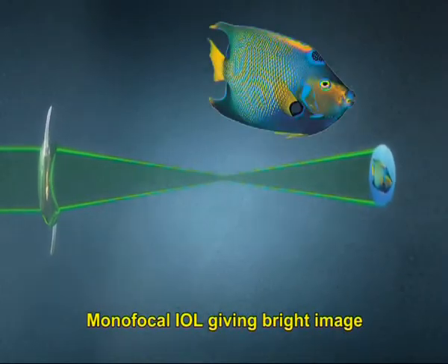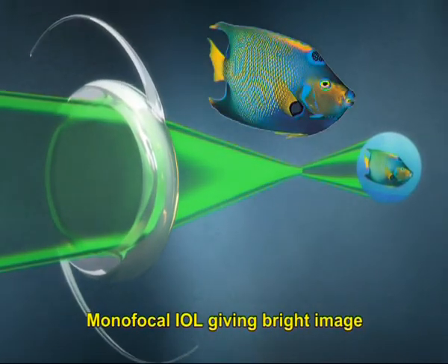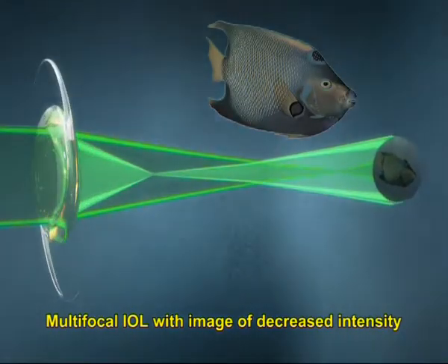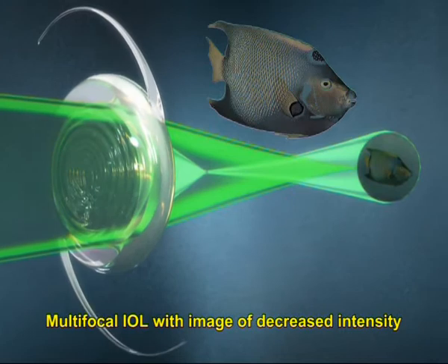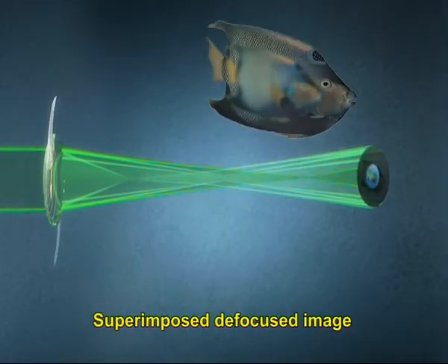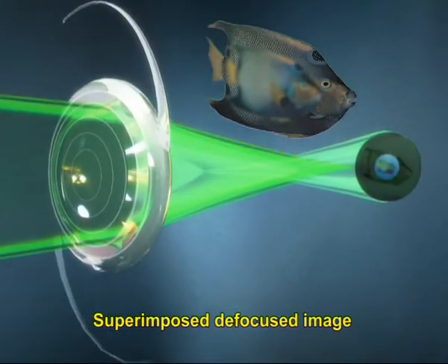Many factors have been proposed for these phenomena, the most important being a decrease in the intensity of light falling on the retina due to splitting up of incident light into multiple focal points and due to superimposition of the defocused image onto the focused image. But irrespective of these factors being common to all patients, not all patients are equally affected by the symptoms.